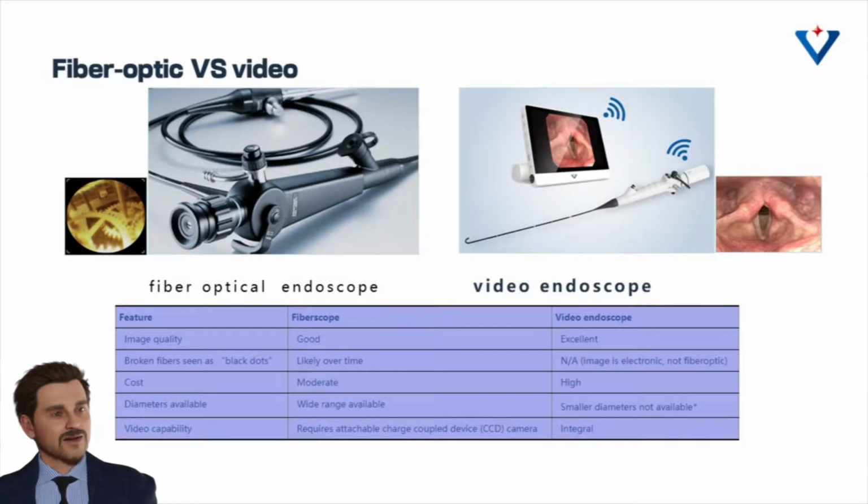A video borescope is designed as a modular unit and can be disassembled into individual parts. The parts include a battery, probe cable and probe tip amongst others. Each of these can be replaced without the owner having to repair the entire unit.